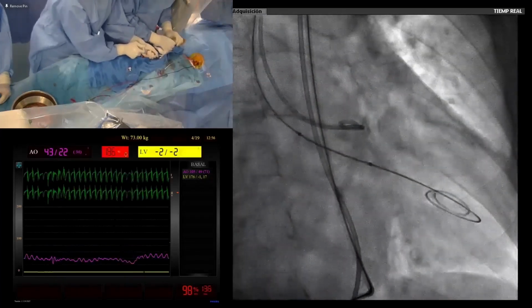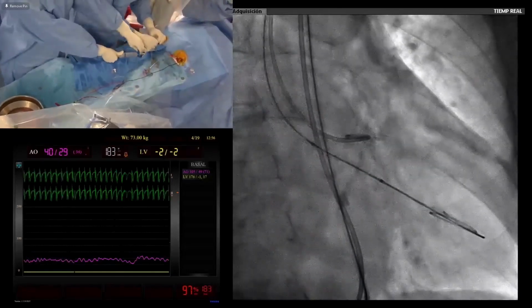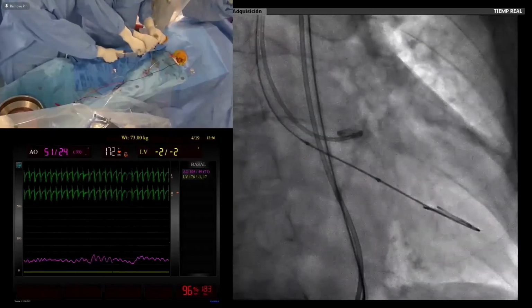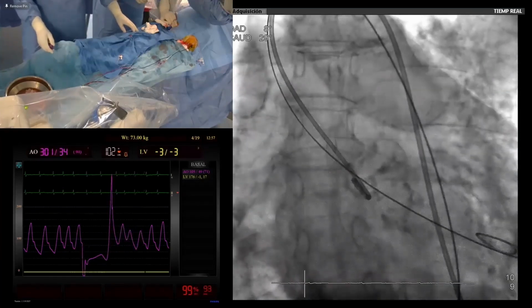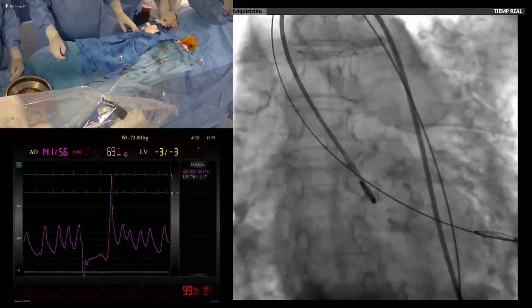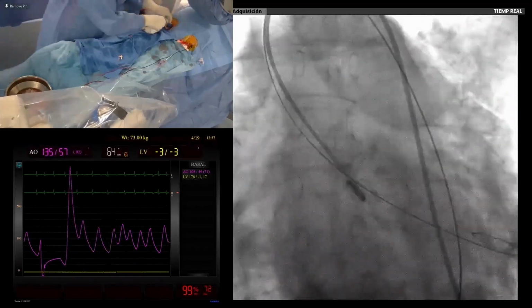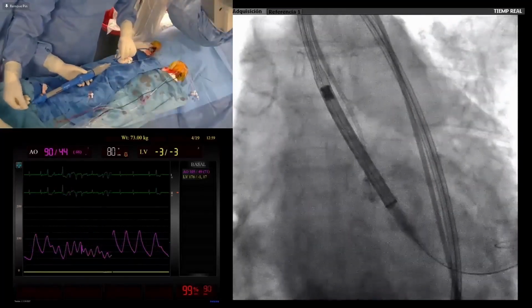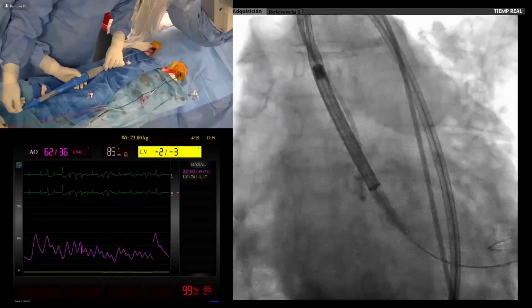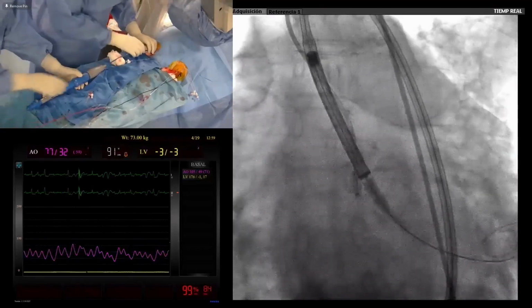Fast. Okay. Perfect. Stop. Let's check. Okay, I think the position is okay. So Carlos is going to hold the groin. I will stay in the middle segment of the pigtail. We'll pull the wire a little bit.